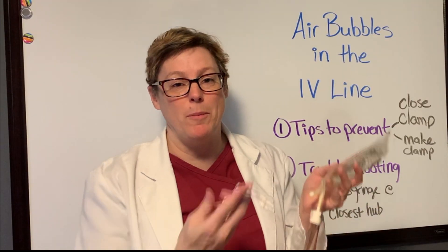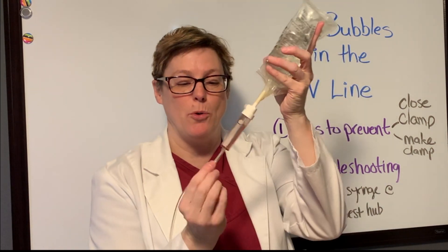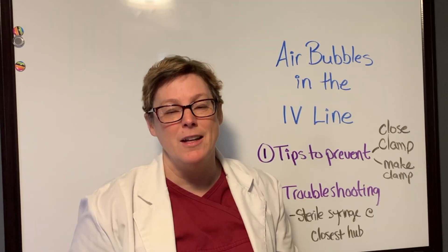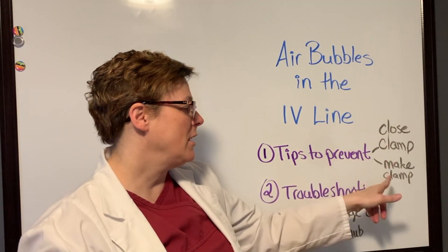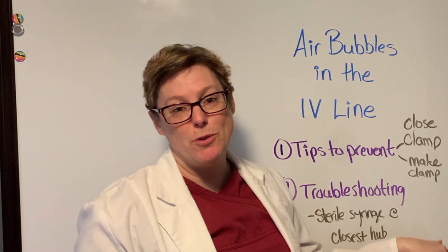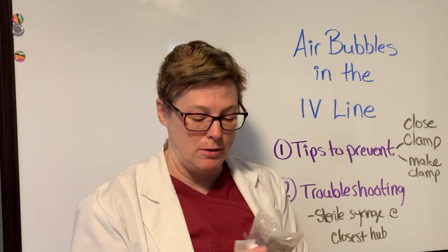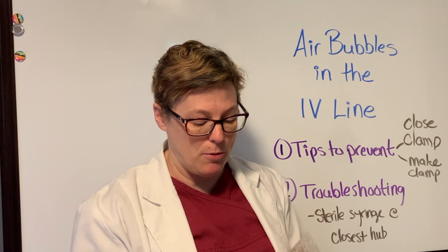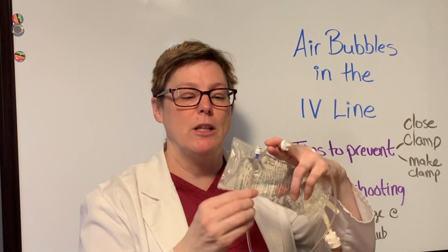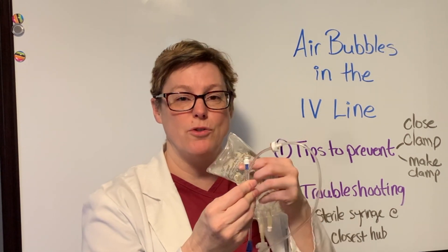As a quick review: before you prime your bag, close the clamp — that's your first clamp — and then make your second clamp by holding the line tight up against your drip chamber. If you need to troubleshoot a bubble, grab a sterile syringe and attach it to the port closest to the air bubble where the bubble has not yet passed. Then clamp below that port, attach your sterile syringe, and withdraw the air.